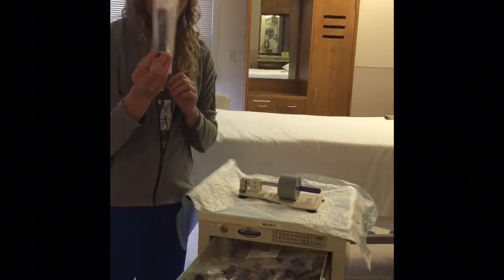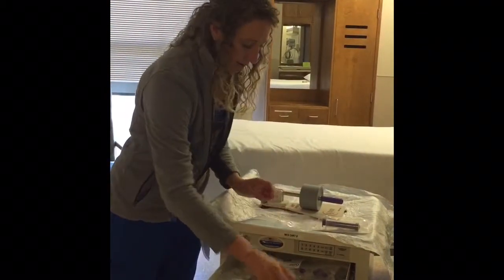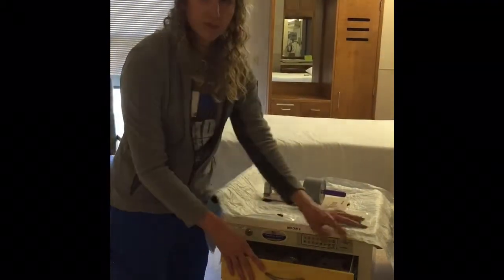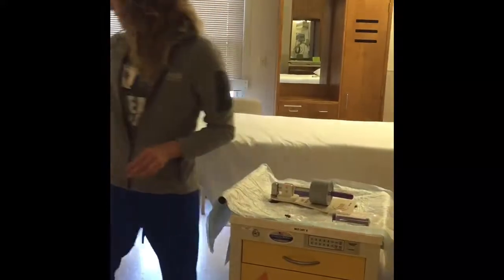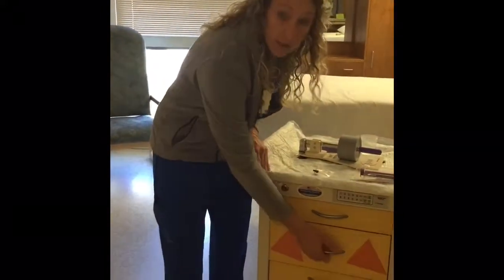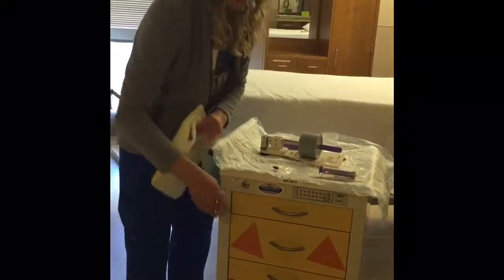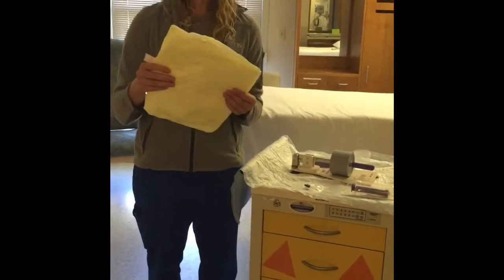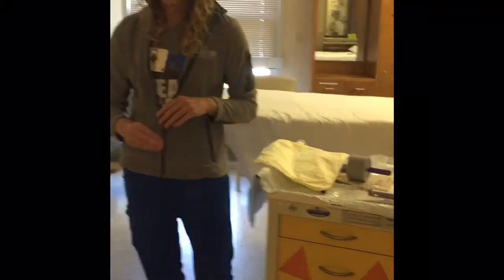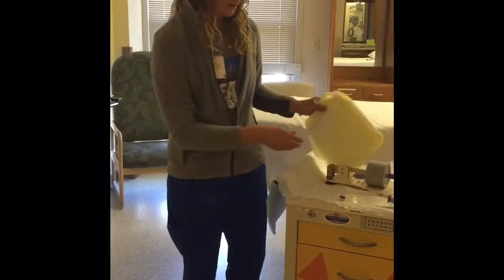We're going to need a purple ENFit syringe, a pill pouch, and then of course your medication and some sterile water. You'll also need, since it is a hazardous medication, either an isolation gown or a chemotherapy gown. So our isolation gowns would be used for our table 2 and 3 meds. The chemo gowns would be used if we're going to be crushing a chemo medication, an oral chemo tablet.